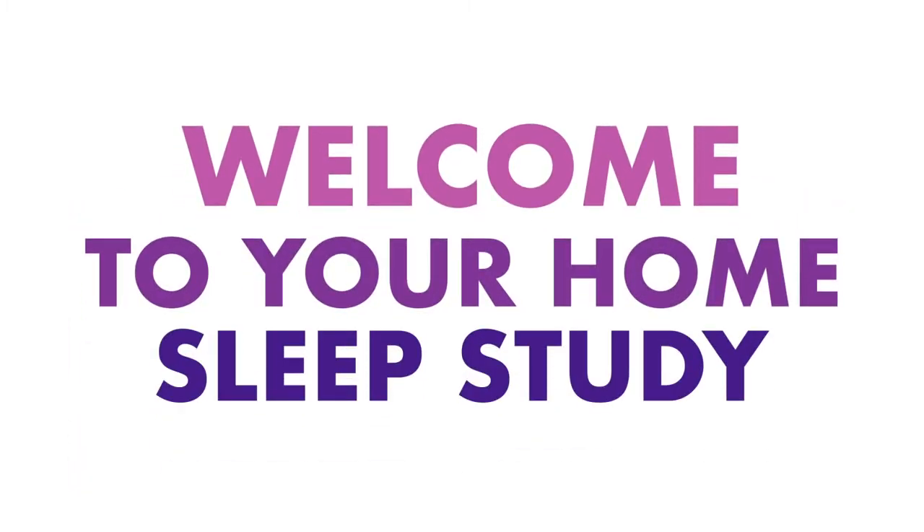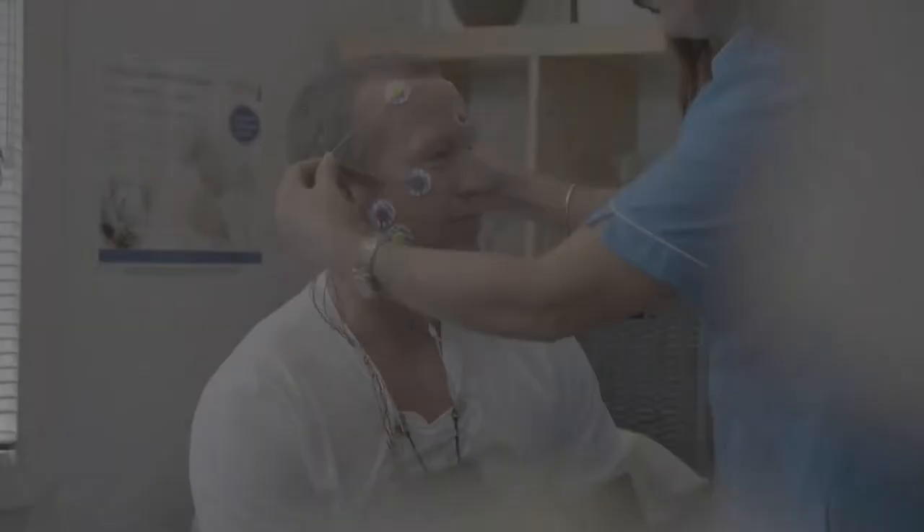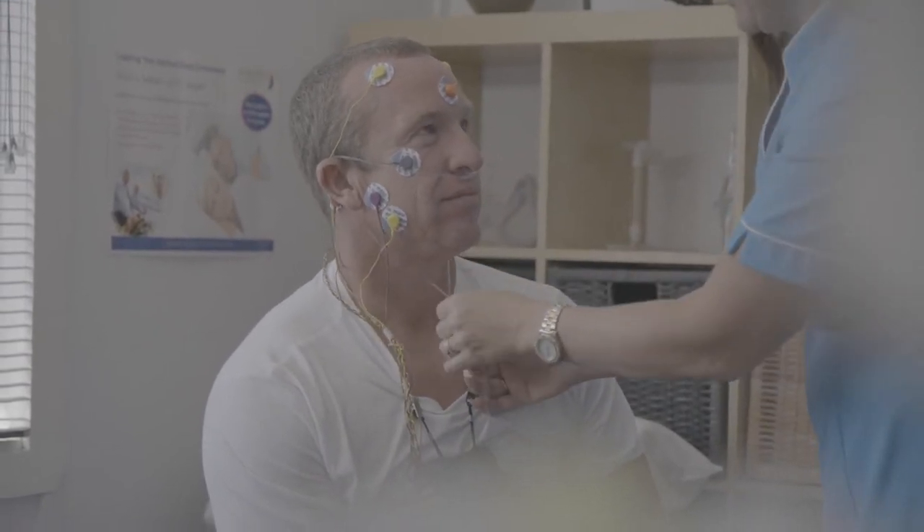Welcome to your home sleep study. You may stop, pause or rewind this tutorial as required. Undergoing a home sleep study allows you the comfort and convenience of being in your own sleeping environment and being able to relax and perform your normal bedtime routine. This video will guide you through the steps to attach the sleep monitoring device sensors correctly.